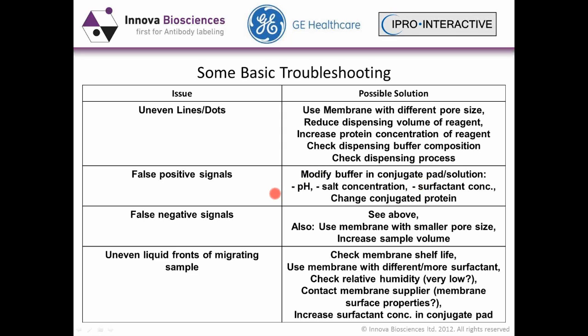The most prominent example that I've seen was an antigen on the test line that was a lectin and that could interact with Fc parts of conjugated antibodies very well and always gave a faint positive signal regardless of what the sample composition was. And at the end of the day, we switched to an F(ab')2 fragment that we conjugated, and then the false positive signal was gone.